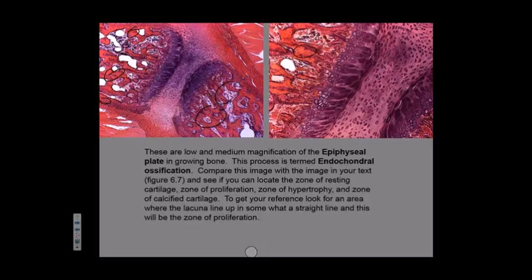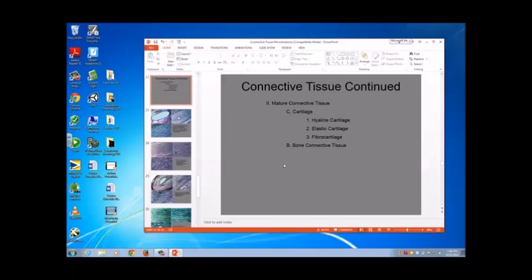So then this is hyaline cartilage right here. Then it changes again, and then it changes again. There's 4 layers of these changes in the development of bone that the hyaline cartilage has to undergo. So this is somebody's finger during embryo development. And you have 2 bones in a finger. And that's it. Let's go to lab, dissect a fetal pig, and send you on your way.